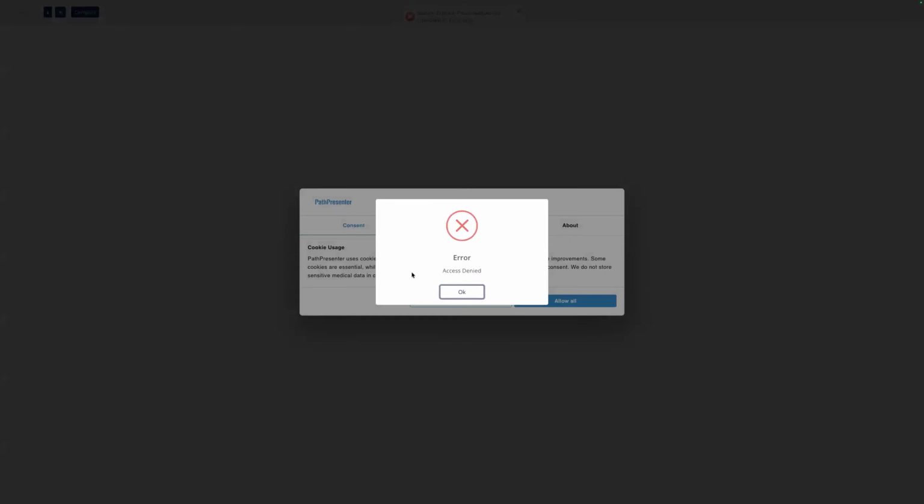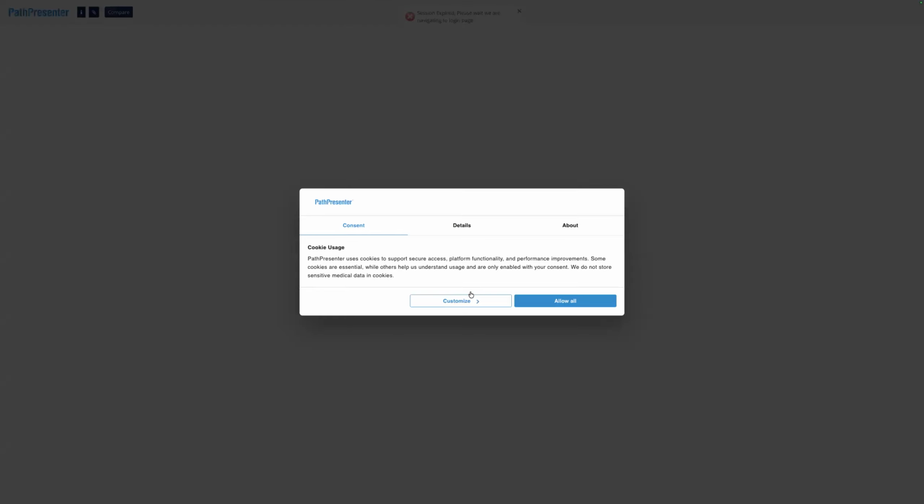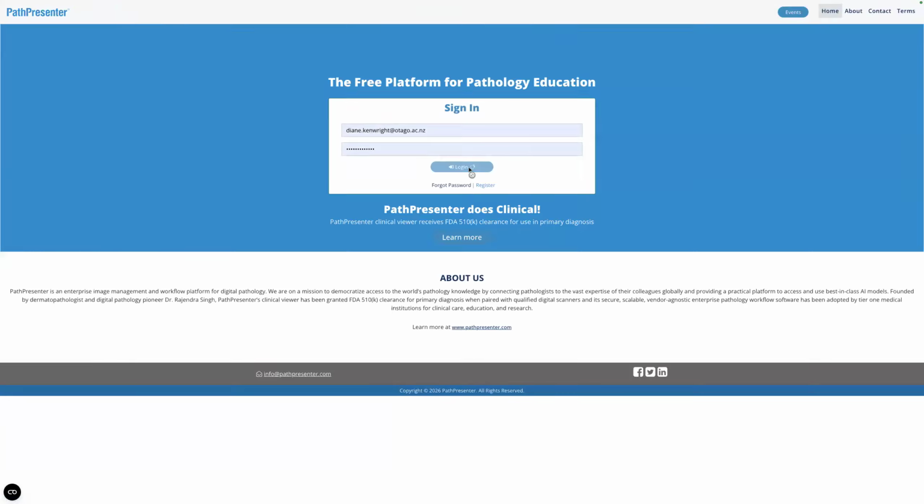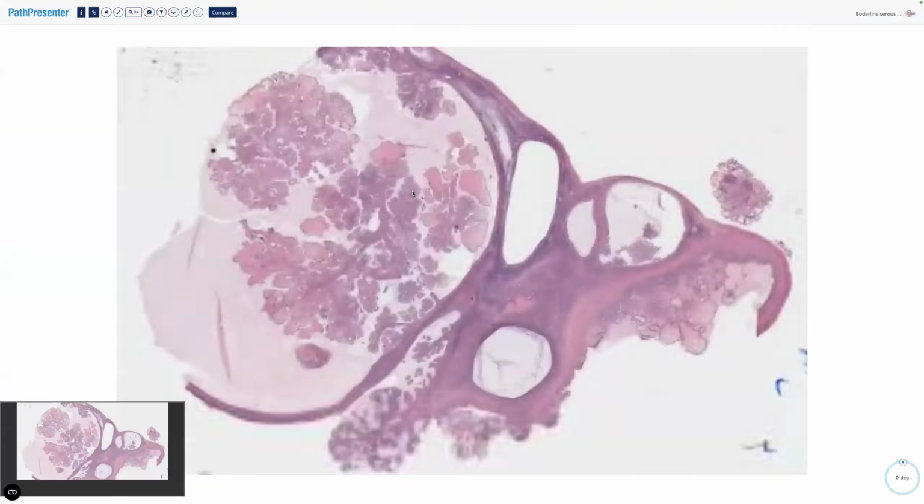All right, serous borderline. No, what's it doing? Oh, okay, it's logged me out. Excuse me, it's logged me out of Path Presenter. All right, log in. All right, here we go.